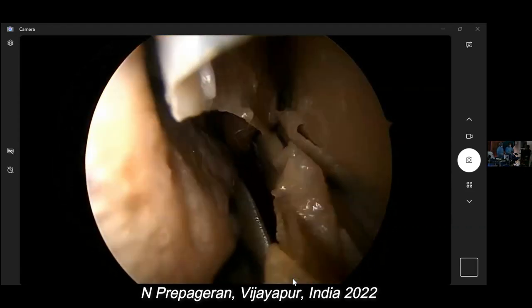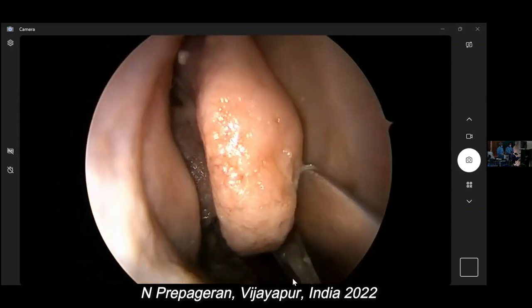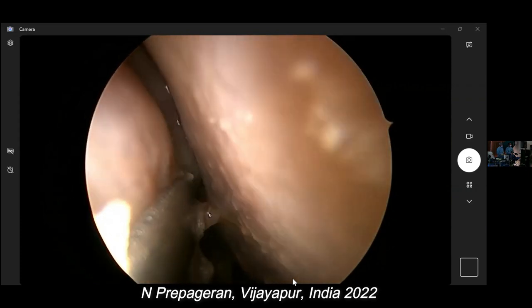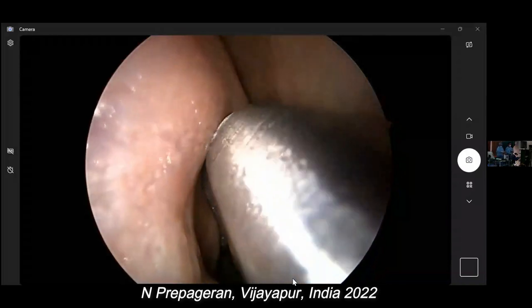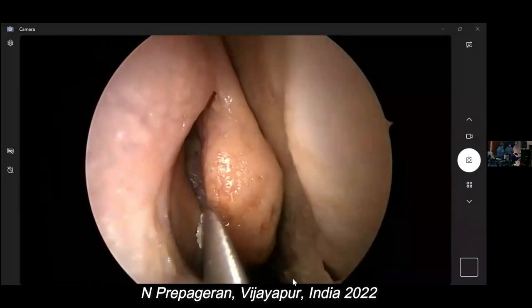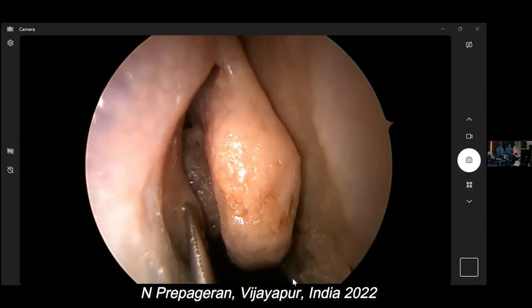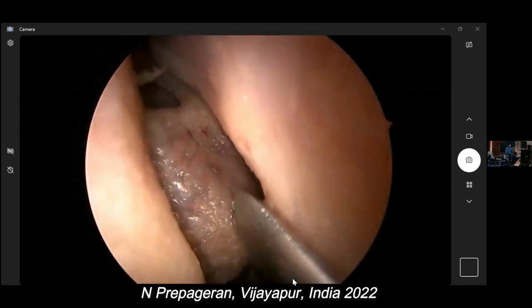Okay, so this is the inferior turbinate. That's the middle turbinate. So if you go medial to this, you will see the superior turbinate, correct? The same way, this will be your maxillary line here where your lacrimal sac would be. So you go into the middle meatus now, and you will see the uncinate process, gate number one. Okay? Gate number two is the bulla.